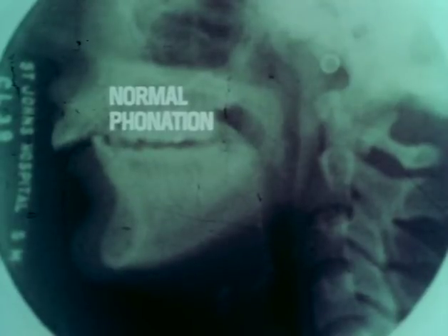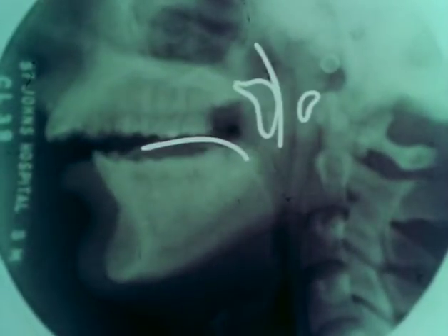Normal phonation, as demonstrated by this 18-year-old postoperative T&A patient. The velum contacts and seals the nasopharynx from nasal air escapage on all vowels and all consonants except the 3 nasal consonants, M, N, and NG. The phonation of ah demonstrates one of the best positions to view the essential anatomical components: soft palate, superior constrictor, arch of the atlas, and the tongue.